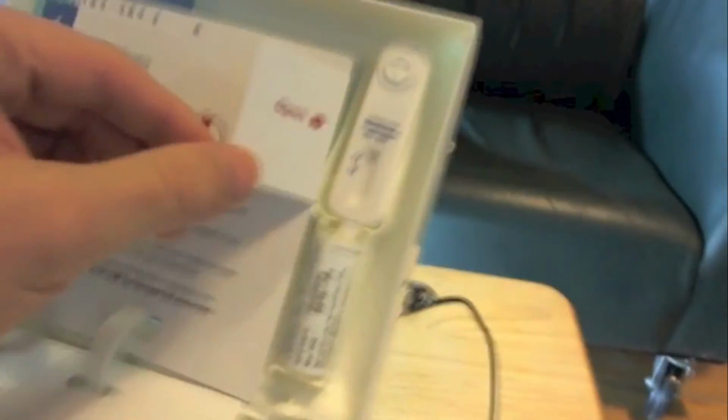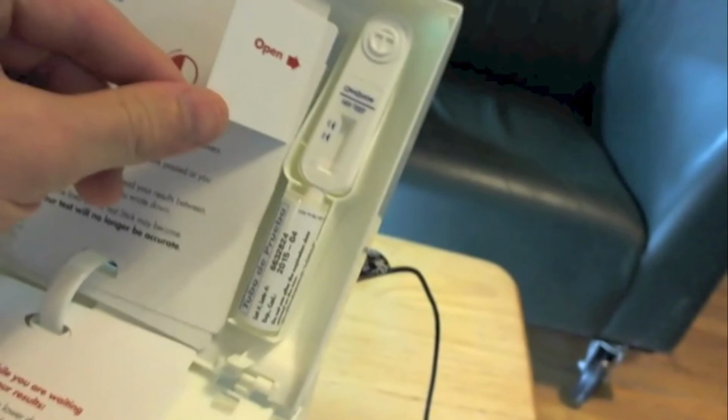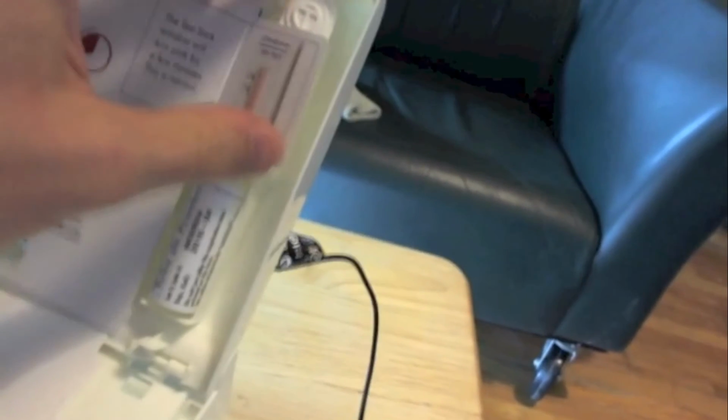It's in the tube. Let's see if we can do this in a good way. Right now it looks like this. So test tube and stick. I'm sorry that it's a bit shaky, and you're supposed to open this flap so you don't stare at the stick, I guess, and then afterwards you're going to get a result. So I guess we're just waiting 20 minutes.